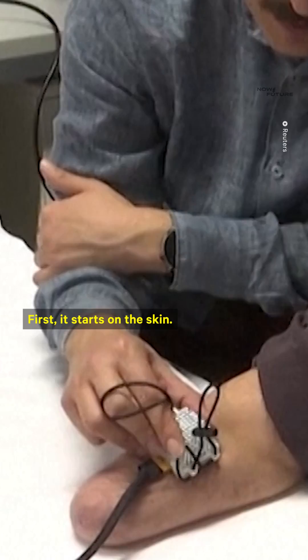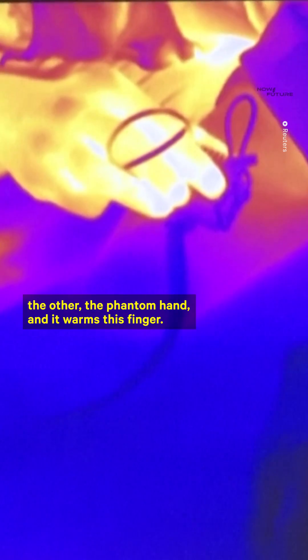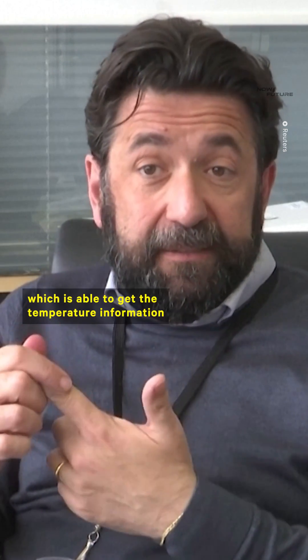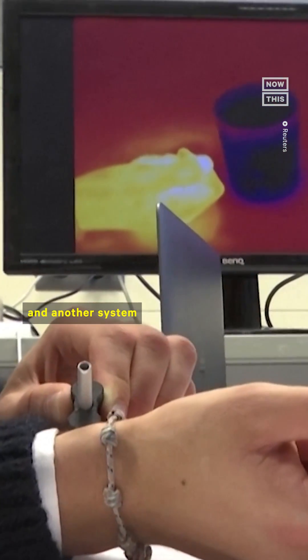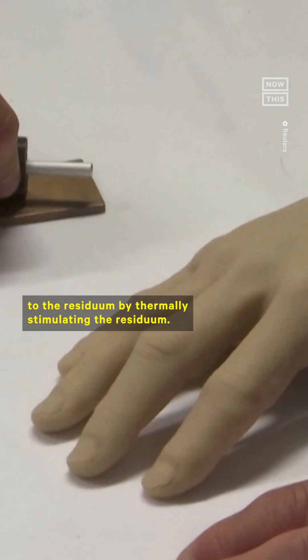Now I feel the heat. First it starts on the skin. The two main components are a system which is able to get the temperature information while the prosthesis is grasping, and another system which is able to deliver this information to the residuum by thermally stimulating the residuum.